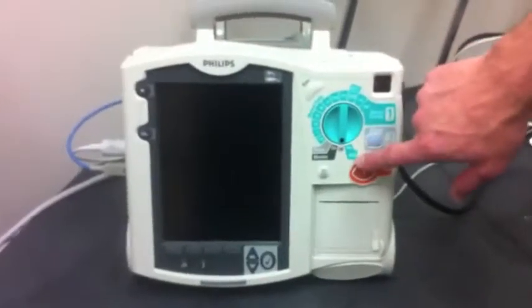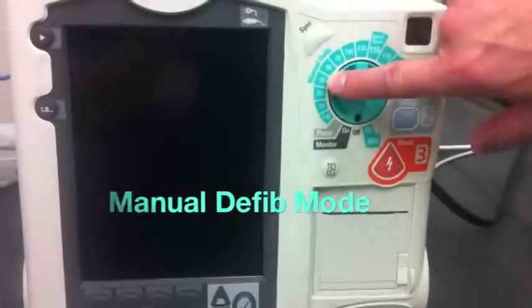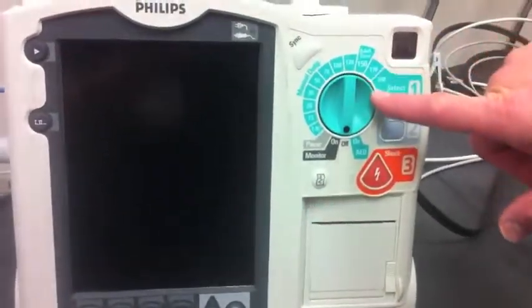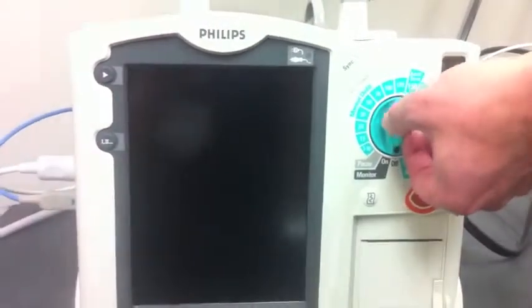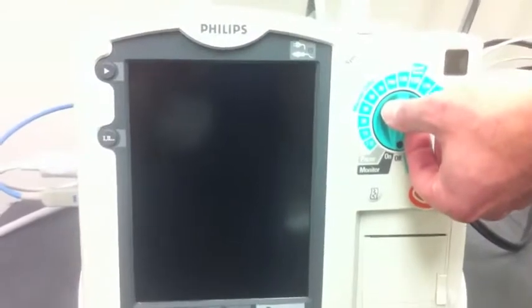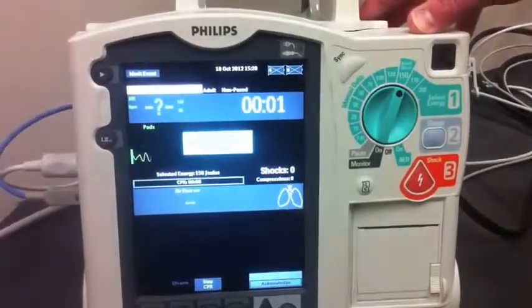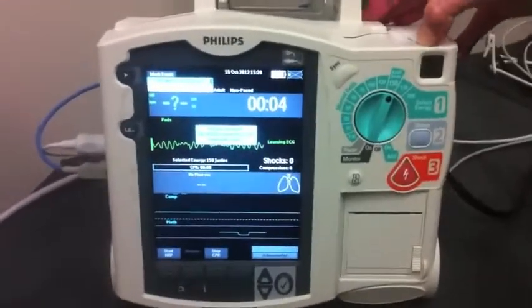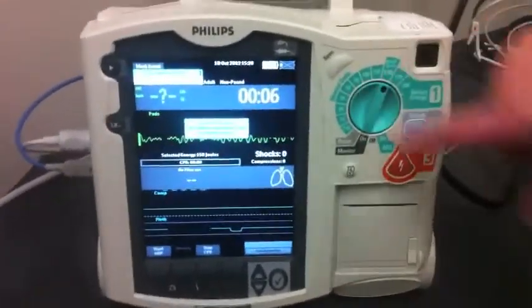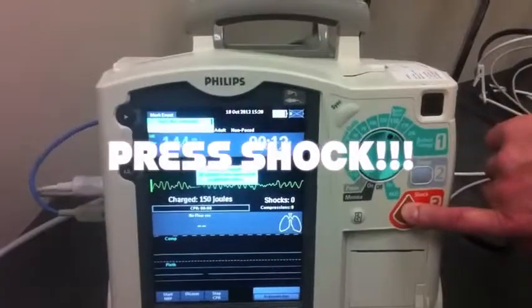For manual defibrillation, instead of coming down to AED, we go up into the manual defibrillation mode. These numbers represent the energy level setting. 150 joules is the adult dose normally started for a patient in ventricular fibrillation or pulseless ventricular tachycardia. On the Philips device, because all monitors or defibrillators are now biphasic, it is dependent on the company to tell you what the adult therapy dose is. We've already turned it to 150.